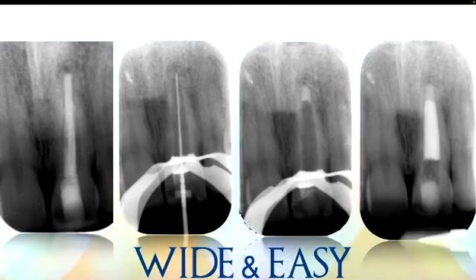So what did I do? I removed the gutta percha that was practically not sealing anything. It's just like a gutta percha point just thrown into the space of that root canal. I shaped, cleaned, filled, made an apical plug with MTA and the back filling with one gutta percha. And then the patient wanted to bleach the teeth, so I put a provisional restoration and we will do the bleaching later.